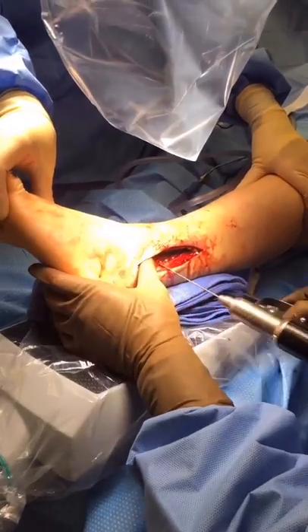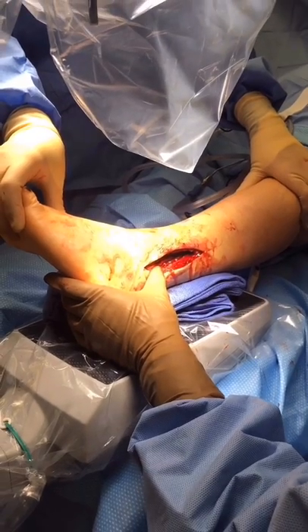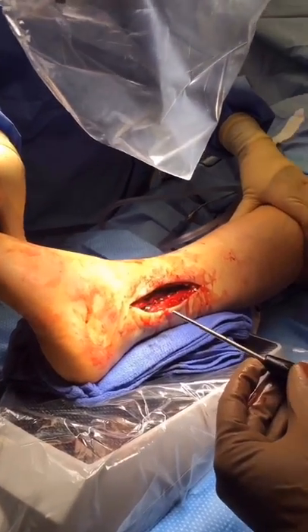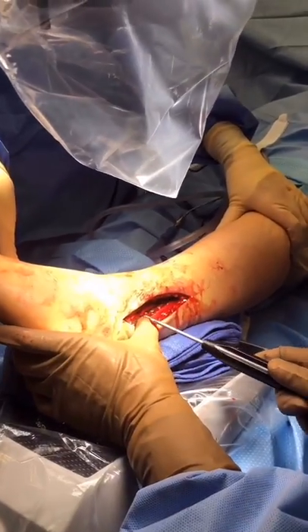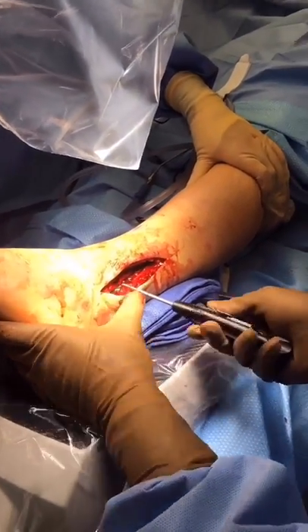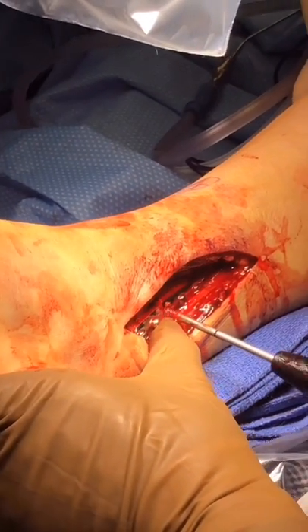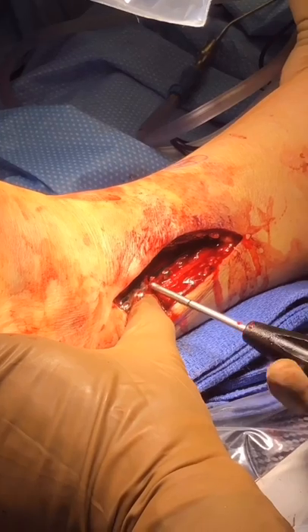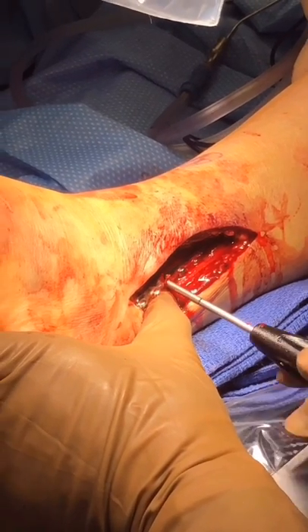Next, the K-wire is removed, and the tibial screw for the Fibulink is fully inserted into the tibia and will come to a hard stop.